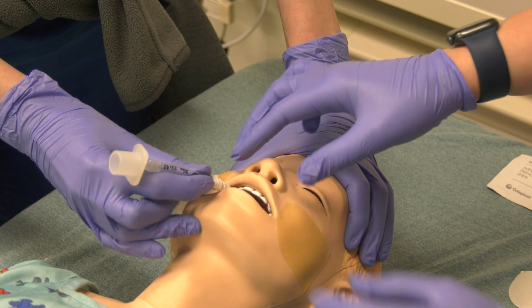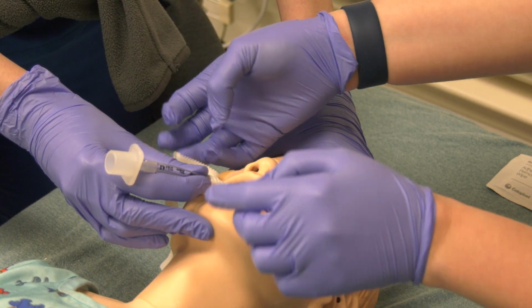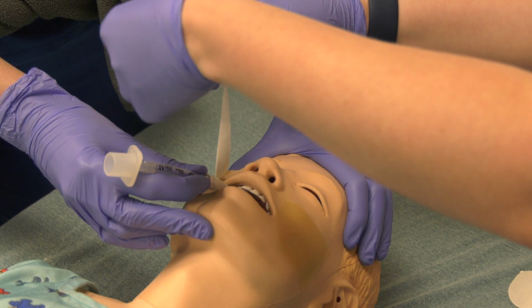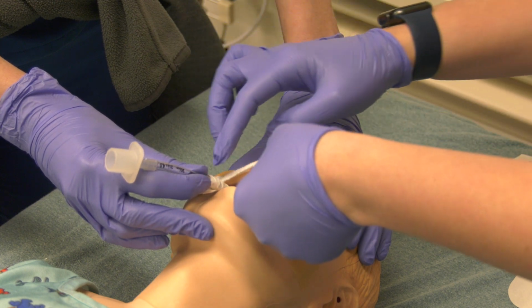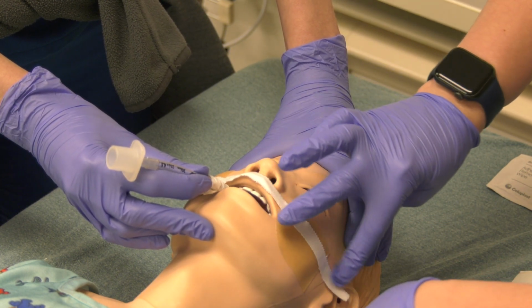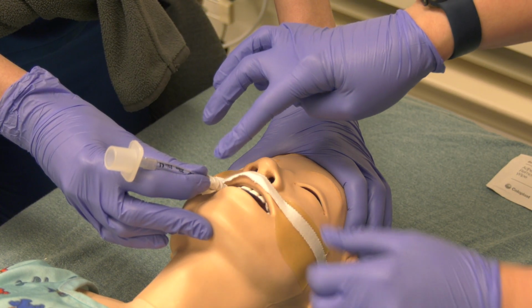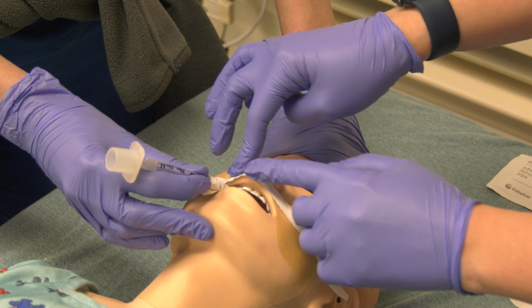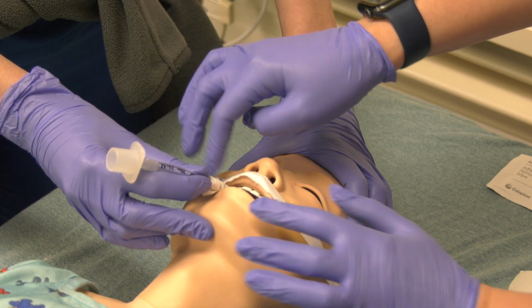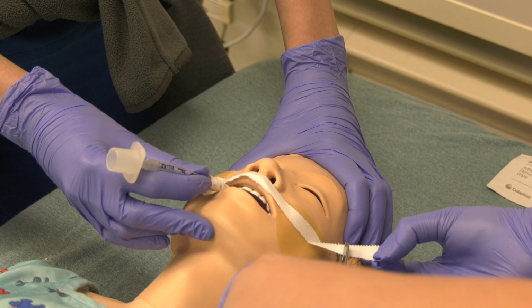After putting the first piece on, I will check again to make sure that the 14 is still visible and still in the right placement. 14 at the teeth. In PICU and CVICU, we will check at the teeth or gums. In NICU, we will check on the lip. And it still looks like 14. I will cut this extra piece over here.